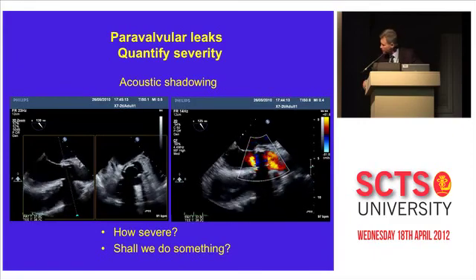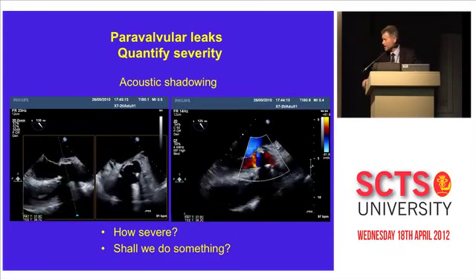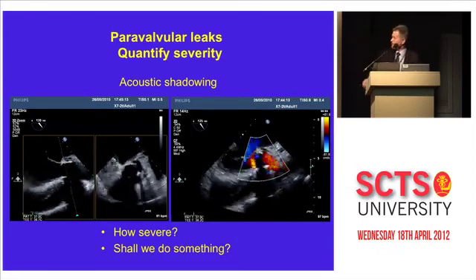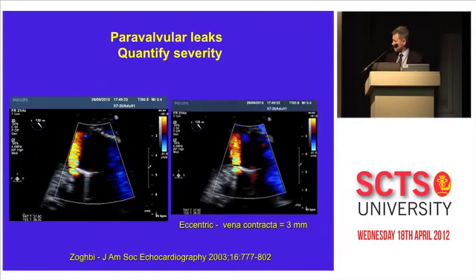One thing I can say from that, in any form of echo pictures, the light is very bright, so it'll be nice if they can turn it down a little bit, because then people will be able to see the images better.